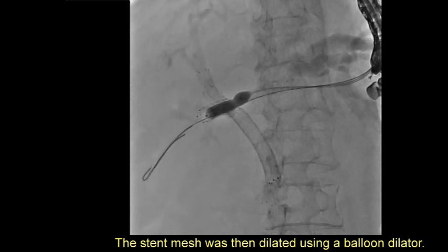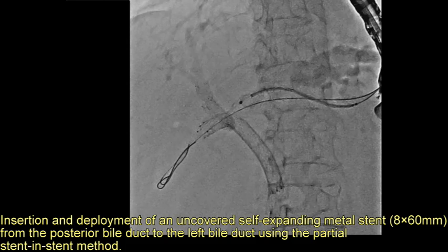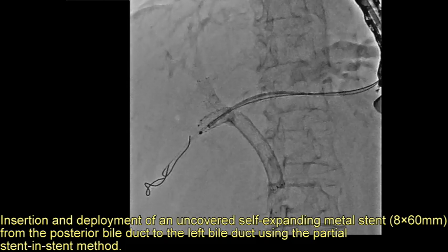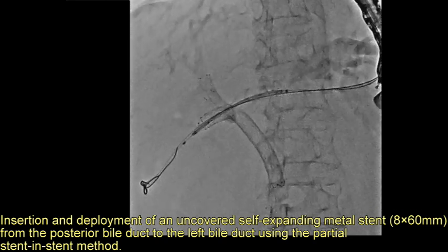The stent mesh was dilated using a balloon dilator. A second uncovered self-expanding metal stent, 8 by 60 mm, was then inserted and deployed from the posterior bile duct to the left bile duct using the partial stent-in-stent method.